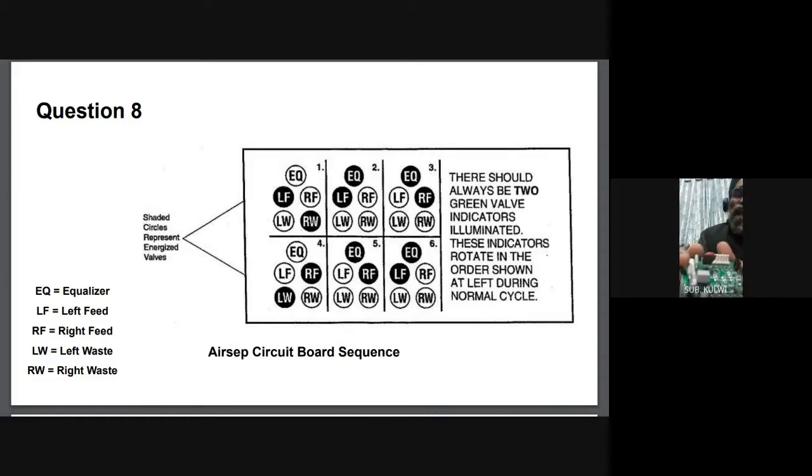Correct? So now the second thing. Here is one capacitor on this. When we switch on the machine, it will not work. It will sound like a choked one, or a short circuit will happen. Then you have to check this capacitor. If it is blown, then we can change this.